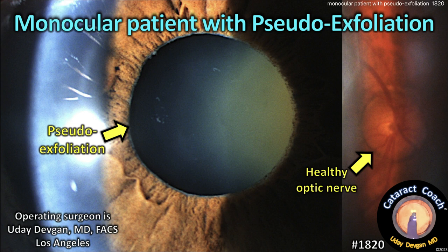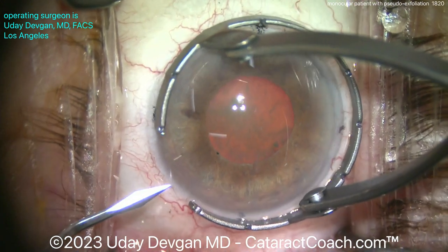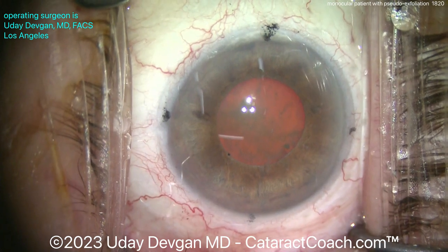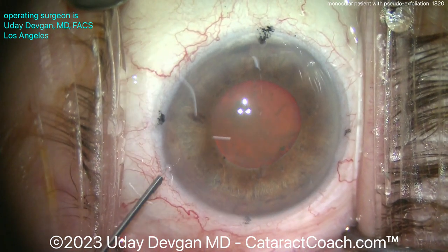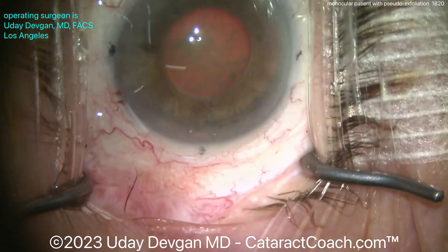cataractcoach.com — a monocular patient with pseudoexfoliation. Look at that pupil, good lens density too, luckily a healthy optic nerve. The patient is the mother of a local LA ophthalmologist and I was asked to do cataract surgery for this patient because she is actually monocular — a tough, tough case. The other eye is in fact no light perception.